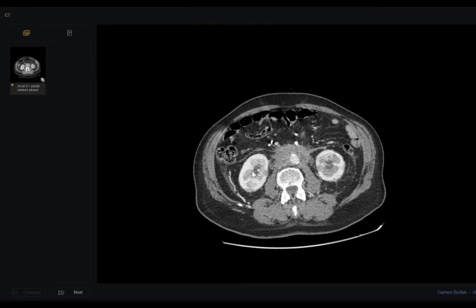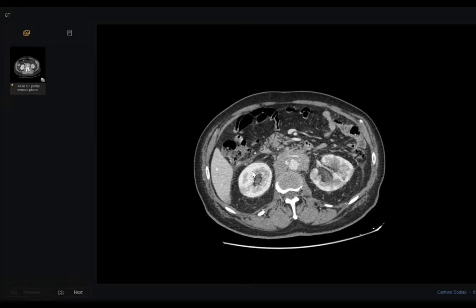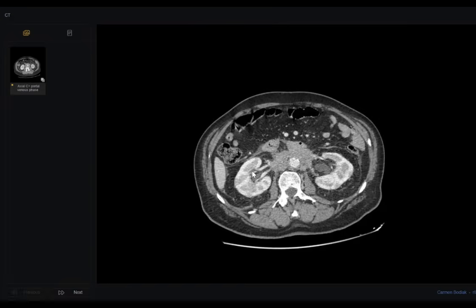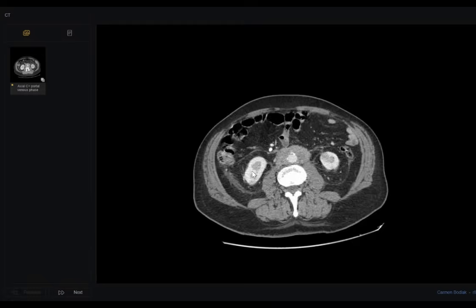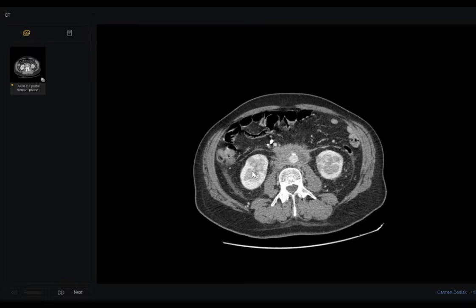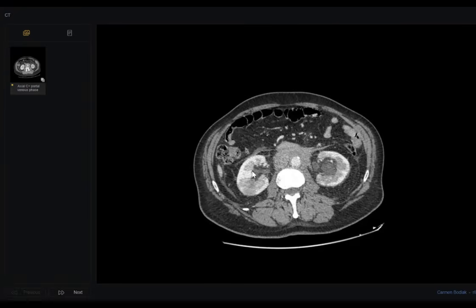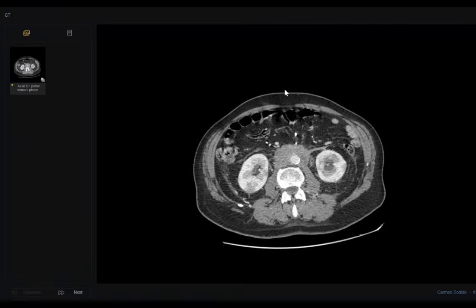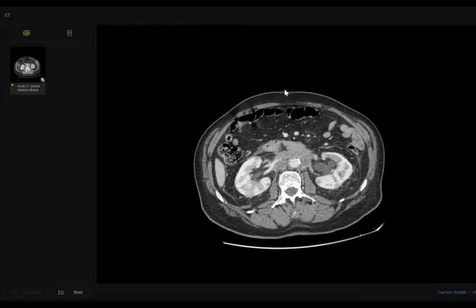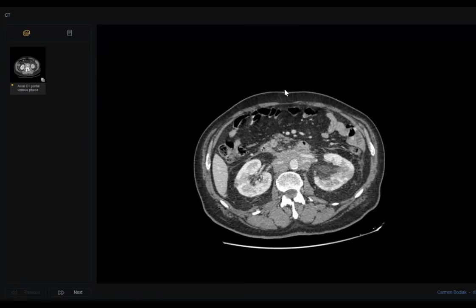I will explain a little bit about CT guided biopsy. In CT guided biopsy, the technician first makes a plain CT and shows it to you, and you and the technician choose a slice using two lines of laser. This guides your needle. First you must choose which slice you want to take the biopsy from. Tell me to stop.